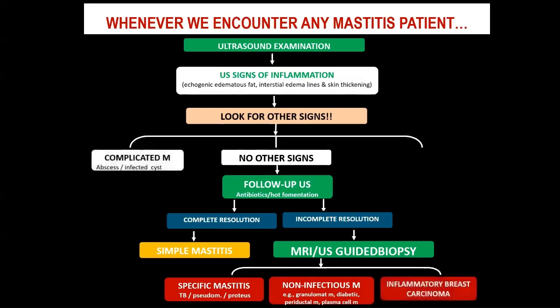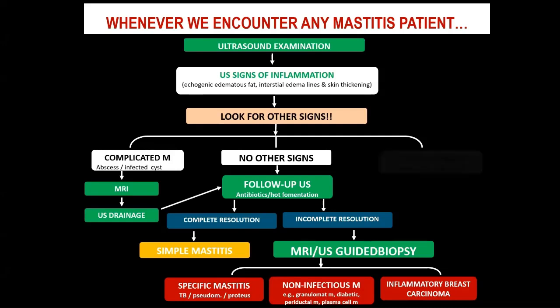If we look for other signs and find associated abscess cavities or sinus tract or infected cysts, we might need to perform an MRI examination, and we should drain this abscess cavity and do a follow-up ultrasound study to ensure that the patient reaches complete resolution.